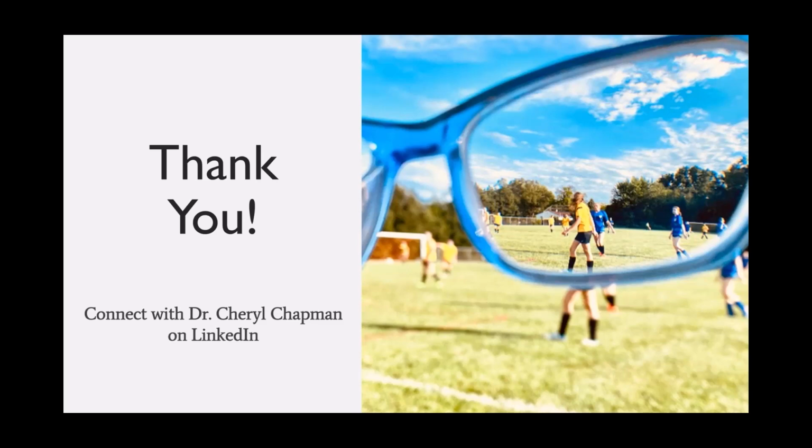Now, if you've got a patient that's older, if they're in their 40s or 50s, or even beyond that, you also need to keep in mind that they've got issues that need to be dealt with regarding their reading power. So in that case, you might want to keep that peripheral power ring a little bit smaller than their pupillary margin so that you get that multifocal effect. But then if it affects their distance vision with glare and halos, that's a problem.